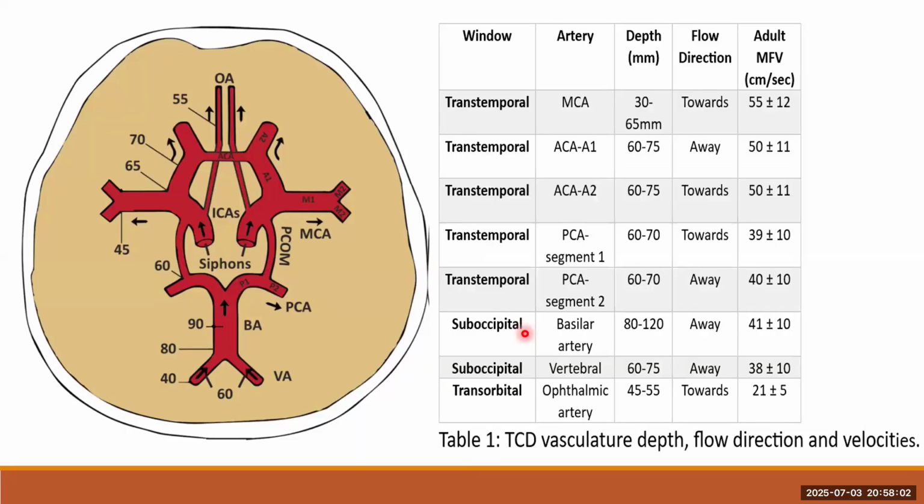This is again the windows and the vessels which we insonate, and the depth and the flow direction. This we need to mug up, or we need to use daily to have it at our fingertips. So the thumb rule being, any mean flow velocity more than 80 is considered abnormal.